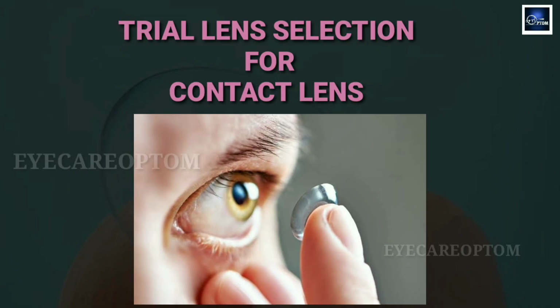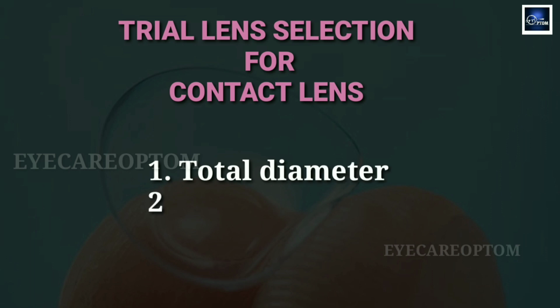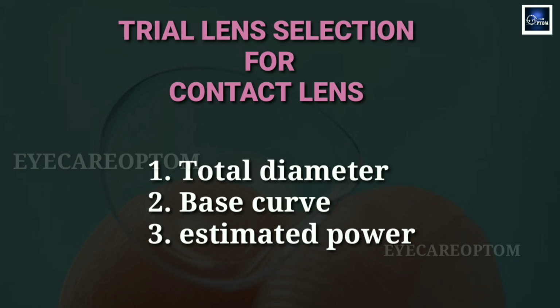Trial lens selection for contact lenses. When it comes to trial lens selection, we should look for three main factors. First one is total diameter for the contact lens. Second one is base curve for the trial lens. And third one is estimated power for the trial lens.